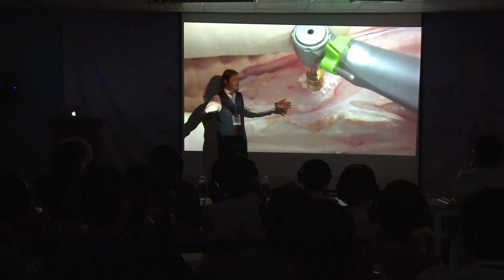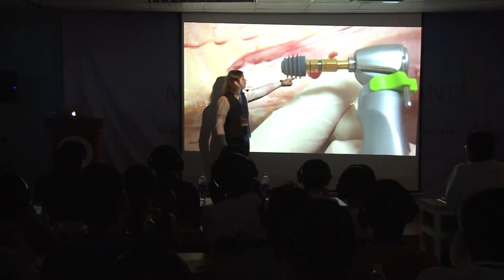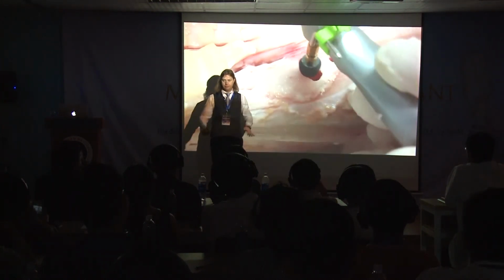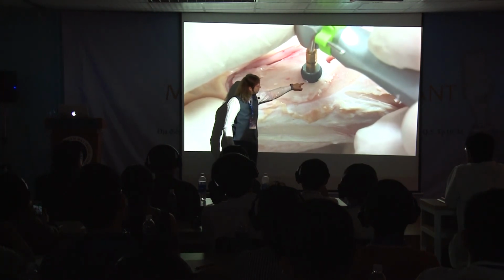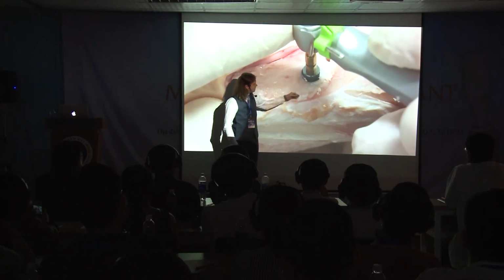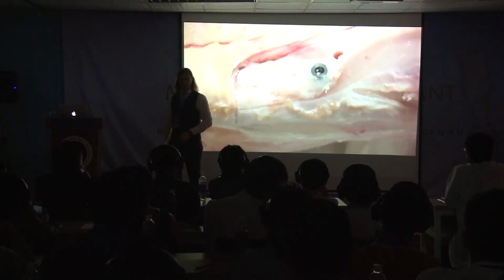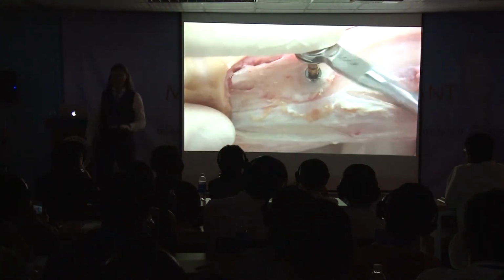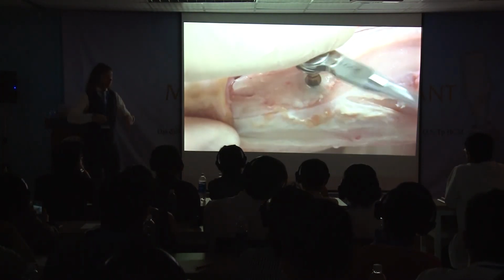This is a wide one, so you can see better. This is a 4.8 hole for a 6 millimeter implant. So it cuts the bone, flows inside, and the bone grows back on top of the implant. It's not normal for the other implant. It's just destroyed. It doesn't come back.